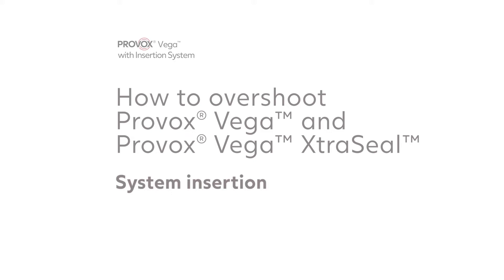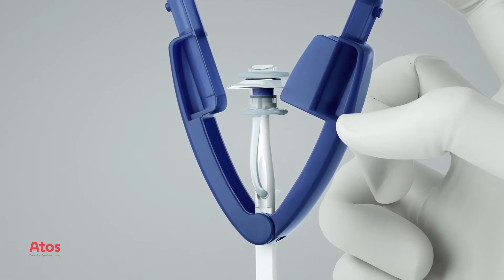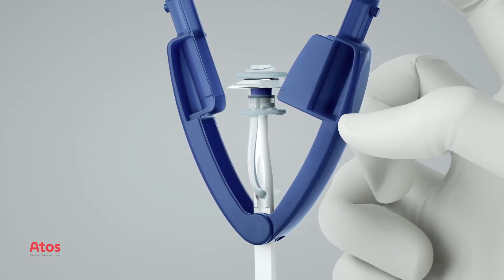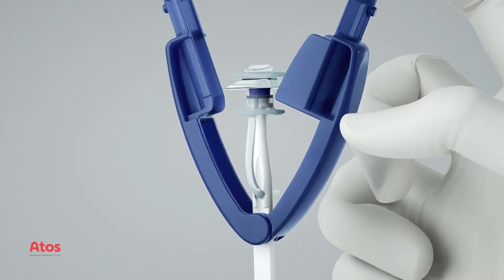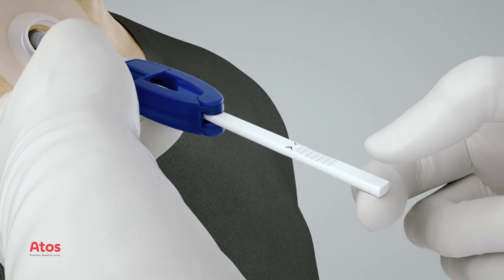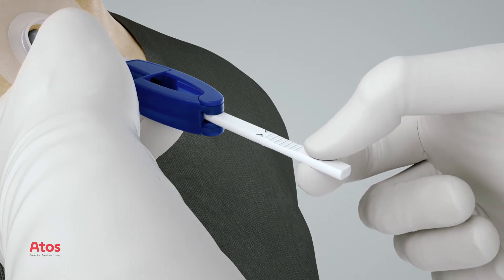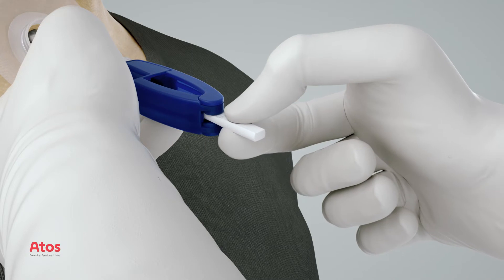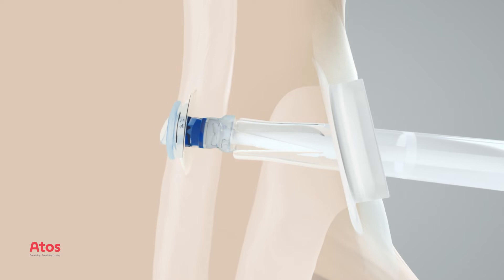In some cases you might want to overshoot to make sure the prosthesis is properly unfolded in the esophagus. Always use overshooting when using Provox Vega extra seal. When overshooting, place your thumb and finger on the smooth surface right behind the pistol grip surface. Push the insertion pin forward so that the ribbed surface enters the folding tool. Now the flanges are unfolded in the esophagus.